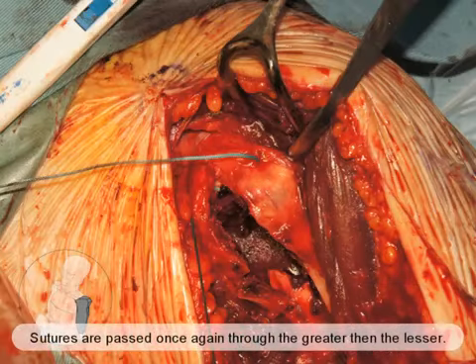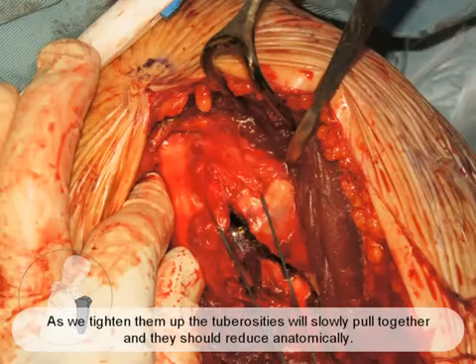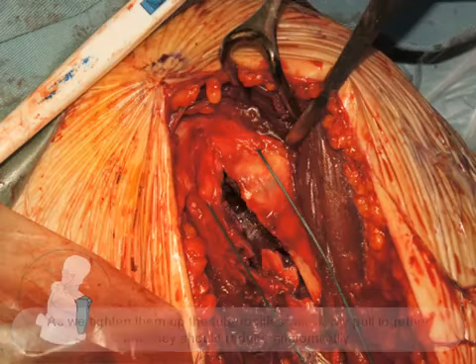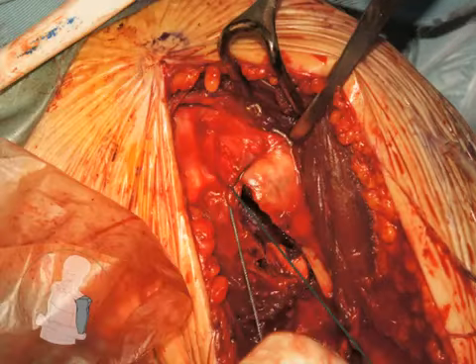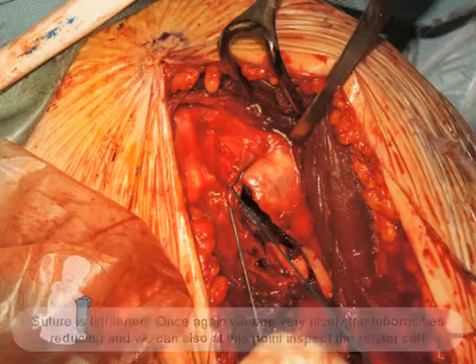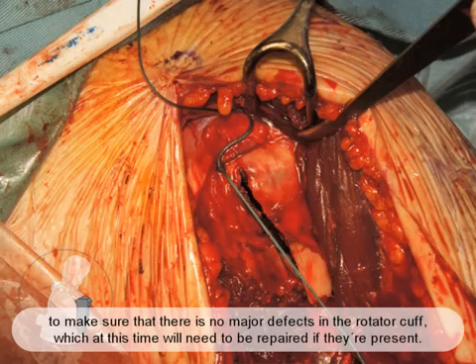Sutures are passed once again through the greater then the lesser. And we see as we consecutively tighten them up, the tuberosities will slowly pull together and they should reduce anatomically. So suture is tightened, and once again we see very nicely the tuberosities reducing, and we can also at this point inspect the rotator cuff to make sure that there's no major defects in the rotator cuff, which at this time will need to be repaired if they are present.